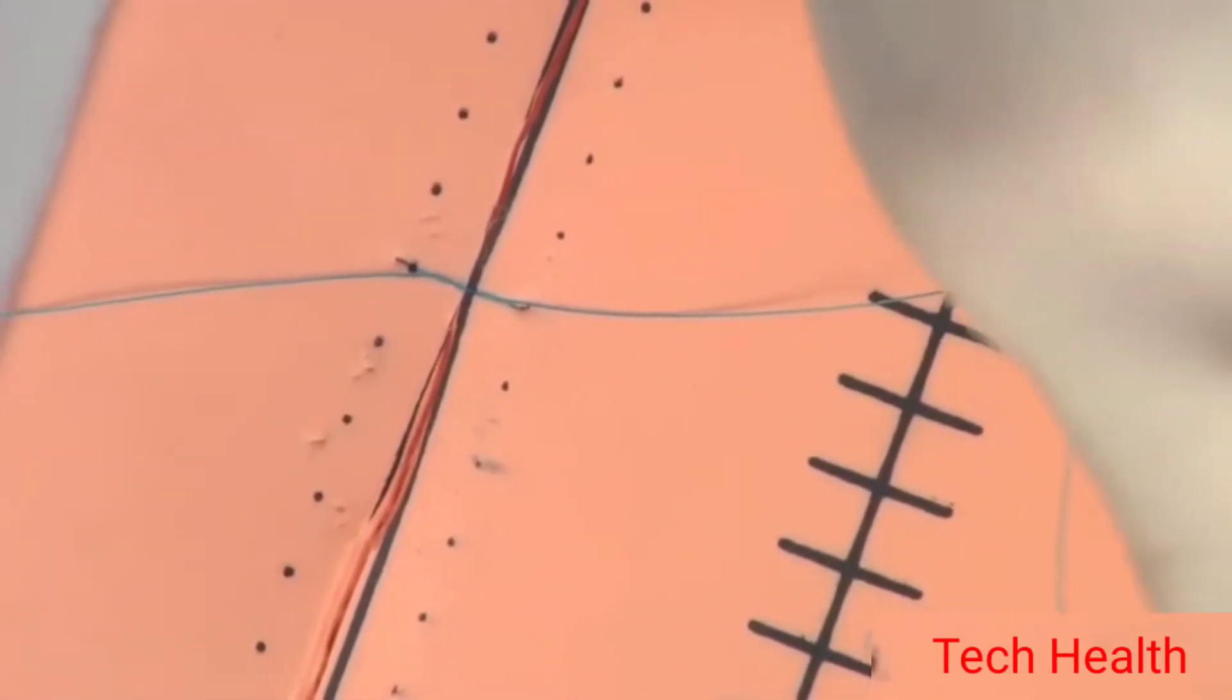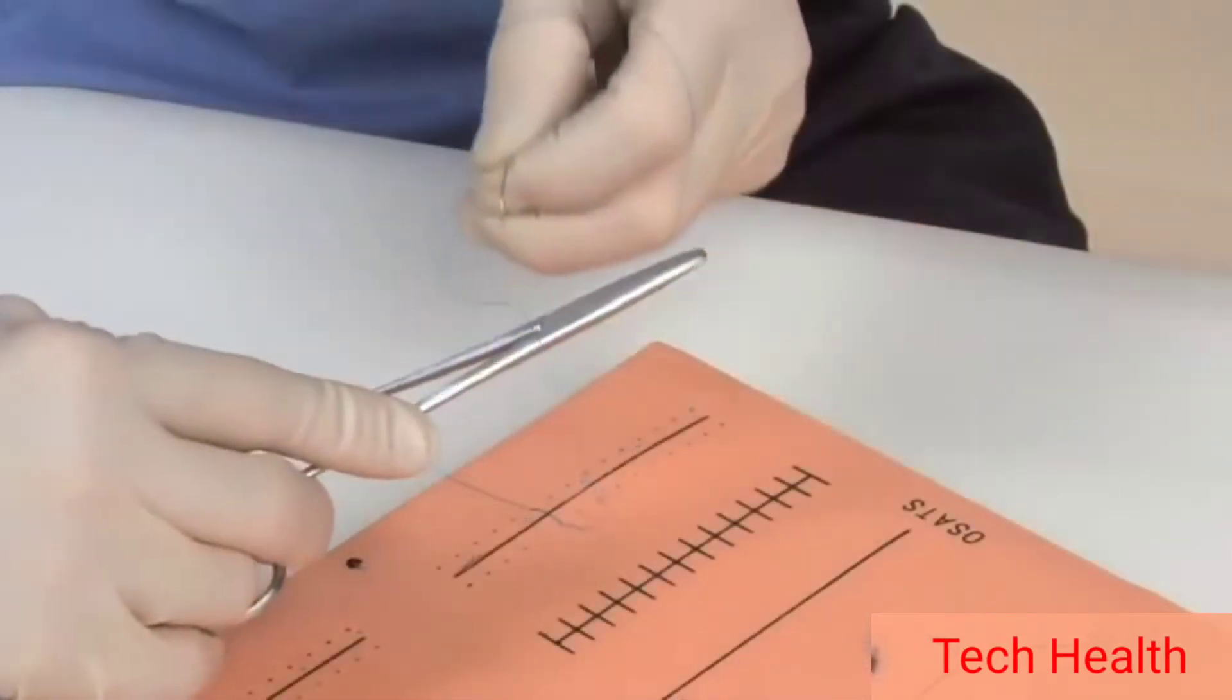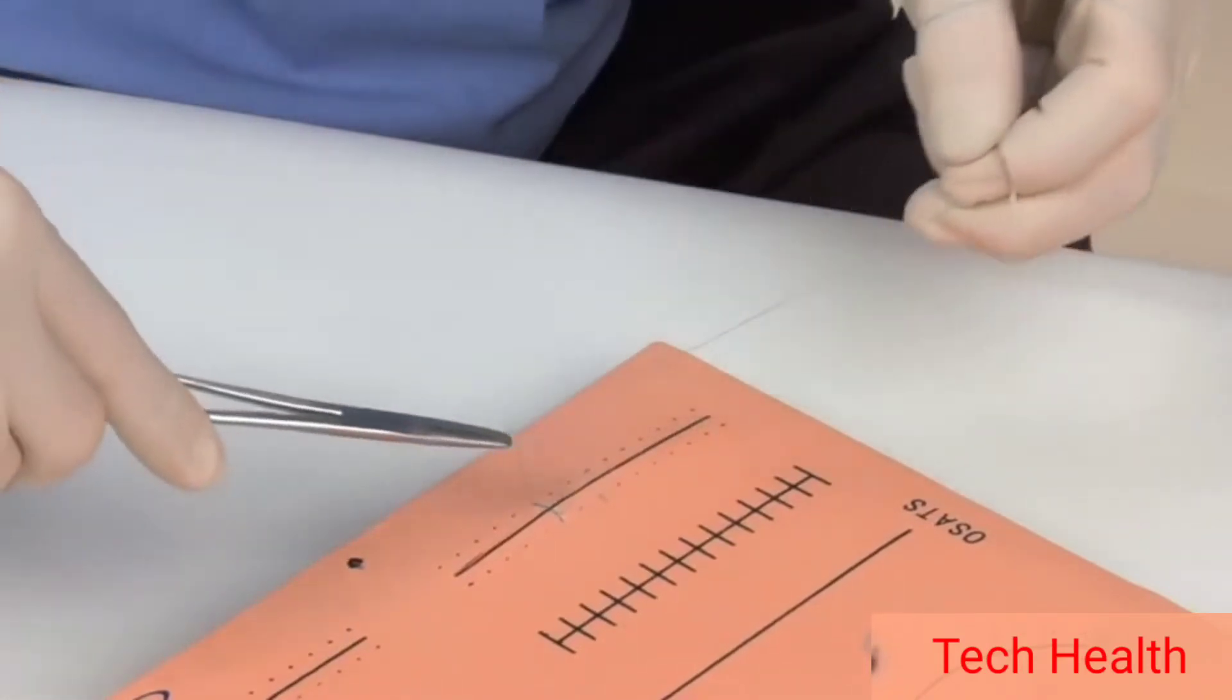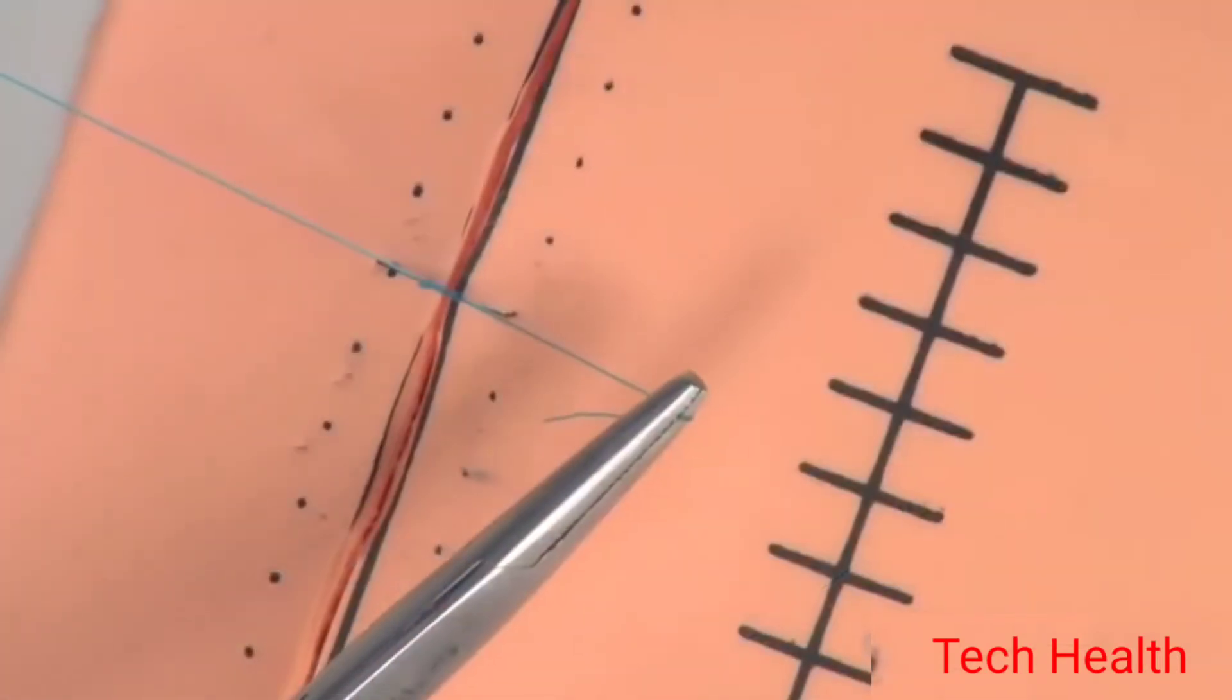Next, start toward yourself with the needle driver. Move the needle driver away into the suture. Wrap it around once, grab the tag, and continue moving the needle driver away from you.